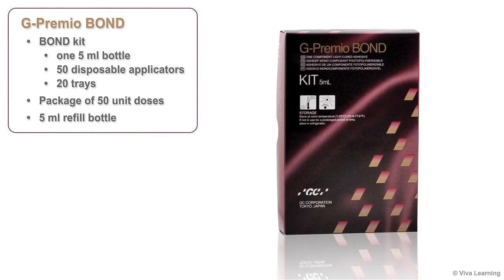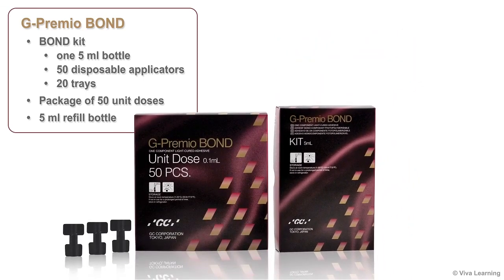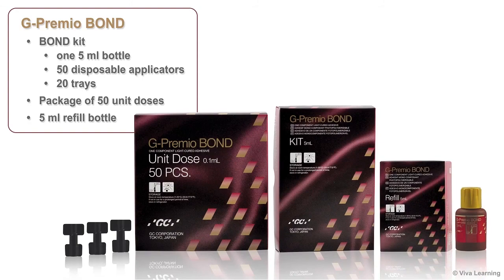G-Premio Bond is available in a bond kit that contains one 5-milliliter bottle, 50 disposable applicators, and 20 trays. You can also purchase it in a package of 50 unit doses or in a 5-milliliter refill bottle.